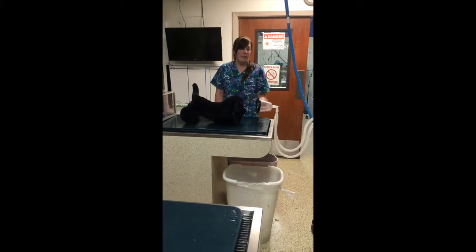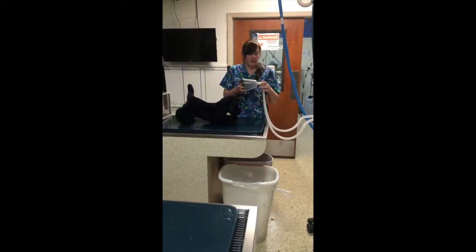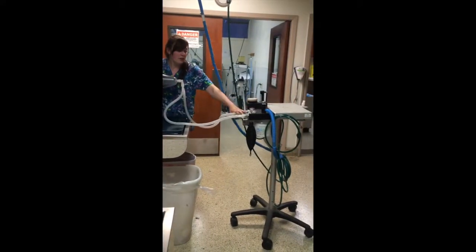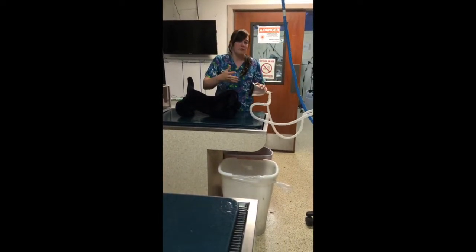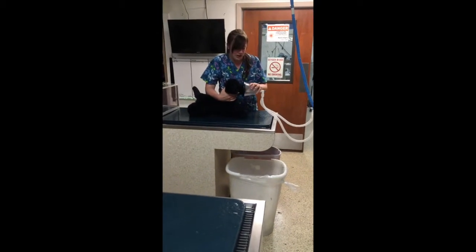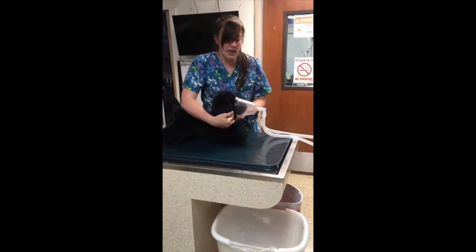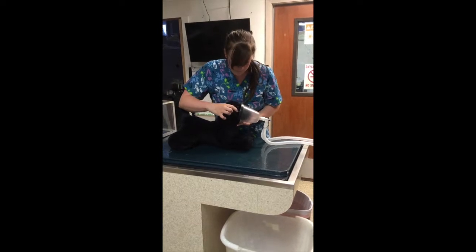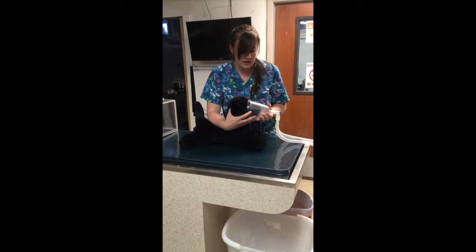All right, I'm going to be talking about mask induction. So when you are doing a mask induction, you want to make sure that you have their masks securely tightened to your tubes that are hooked up to your anesthetic machine. This one is hooked up to a rebreathing machine, so the patient can inhale, exhale freely, pop-off valves open. So when you want to do this, you want to hold your patient, and cover the entire muzzle inside that cone, because you don't want any anesthetic gases to leak around the muzzle. So you can see this is a good fit. It is tight around the muzzle, and you're just going to want to hold that mask up against the patient.